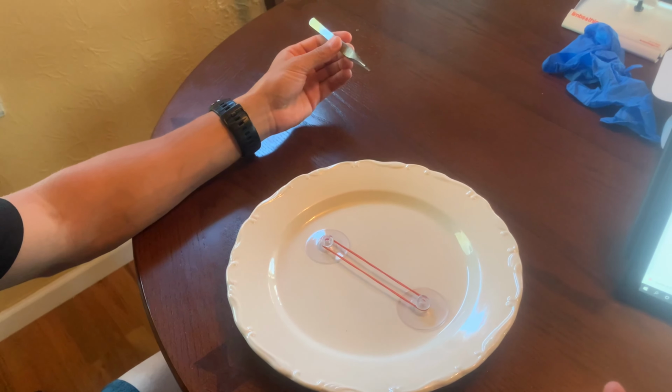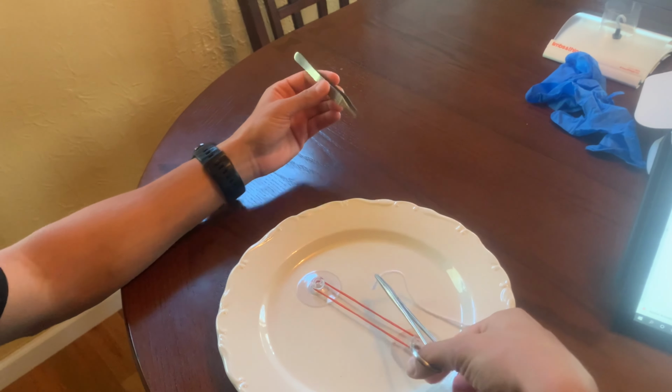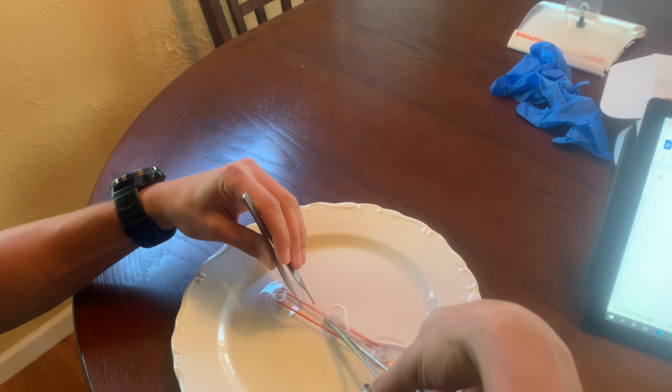I'm about to explain the procedure while Tyler performs it. All right, this is Tyler, and he's going to do a one-handed surgical knot procedure. So first, he begins by passing the needle and the suture through the two ends of the incision with the needle driver, and passing the long end of the suture into the left hand.